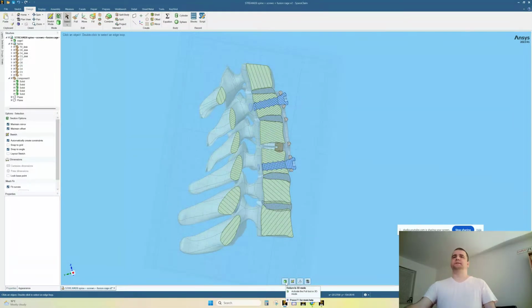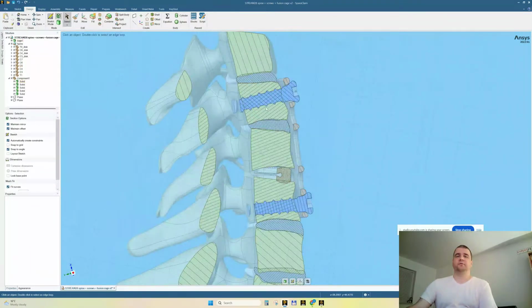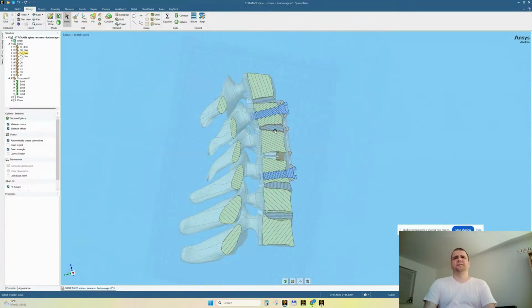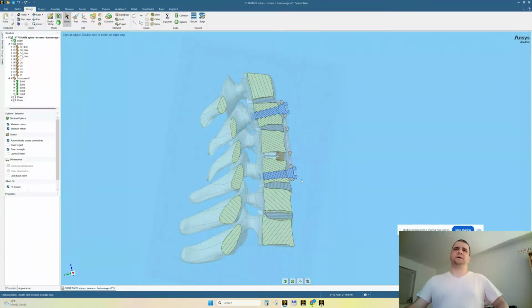All right, now we need to do the Boolean operation, the combine operations in SpaceClaim. Oh my God, the modeling takes so much. If you don't have the time, the patience to wait, go towards the end of the live stream, where you will see FEA results. The modeling takes so much time that I think I'm going to do it in Explicit Dynamics directly, because there we have easier body interactions.